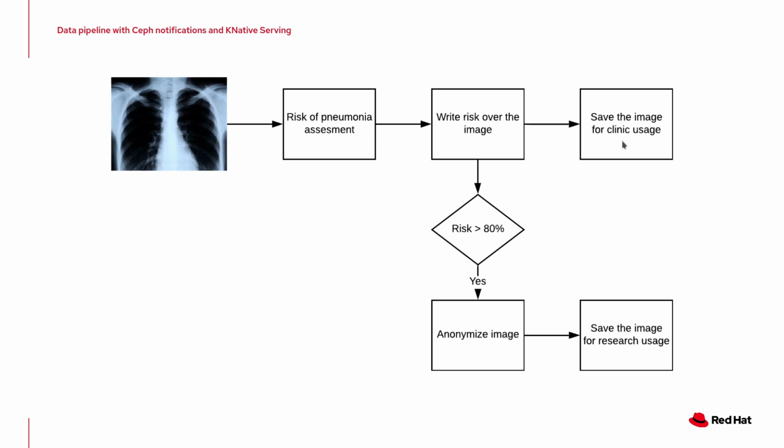But what we want to do also is, if there is a risk of pneumonia that is over 80%, we want to anonymize the image and save it somewhere else, but this time for research usage.